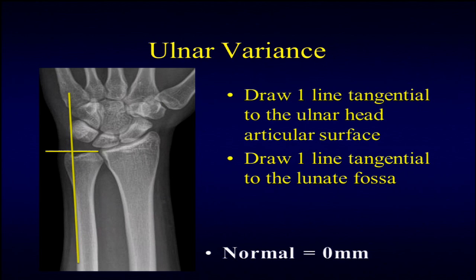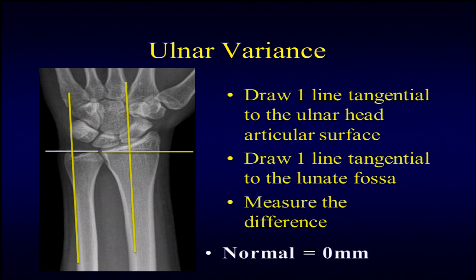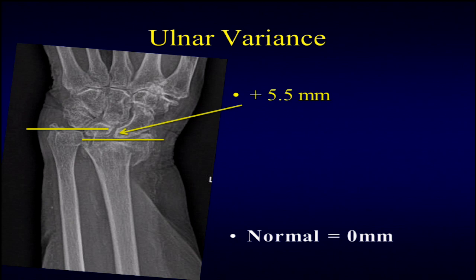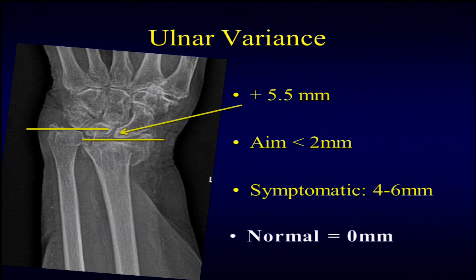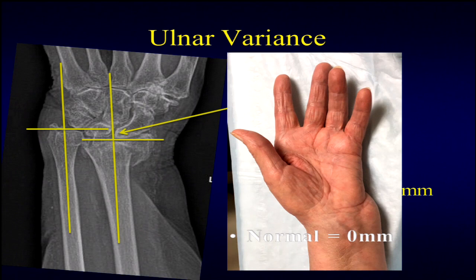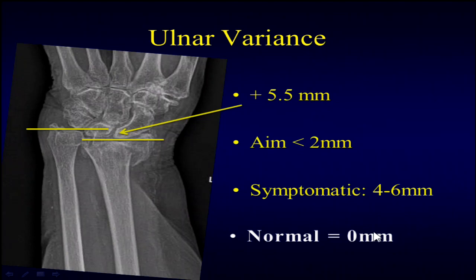For ulnar variance, you draw lines tangential to the surfaces of the ulnar head and the ulnar aspect of the distal radius. Most patients should be about 0 millimeters; plus or minus 2 millimeters is usually my standard. In this patient we can see about 5.5 millimeters of prominence of the ulnar head, which will lead to ulnar abutment. You can see how prominent that ulnar styloid is. Anything above 2 millimeters pushes me towards operative, and 4 to 6 millimeters will definitely cause symptoms. You can also discuss with the patient treating nonoperatively first and returning for a DRUJ procedure.